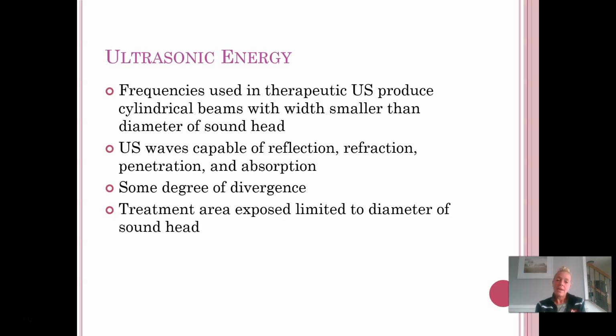The treatment area is going to be limited to the size of your ultrasound head. You're going to hear this probably a million times, but we typically try to keep our treatment areas no more than 2 to 3 times the size of our ultrasound head. Most of our machines have one ultrasound head that is fitted for them. We do have one machine where we have 2 different sizes. So you'll see that you can sometimes change the size of your ultrasound head based upon the size of the area that you're trying to treat.